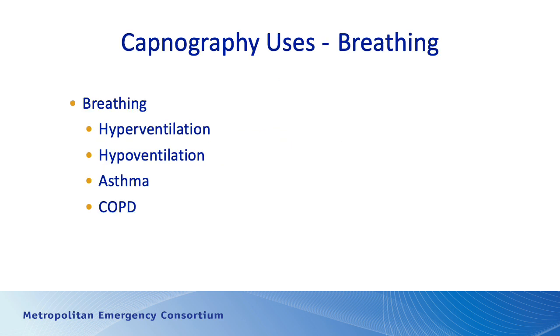So capnography, use it for breathing purposes, where we can use it to watch or observe or evaluate for hyperventilation or for hypoventilation. We can also use it as we treat patients for asthma or COPD. We can use it with asthma and COPD to get an indication of severity of illness. We can also use it to determine if the patient has improved during the course of care.